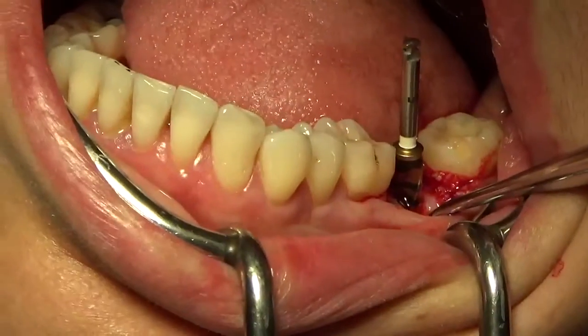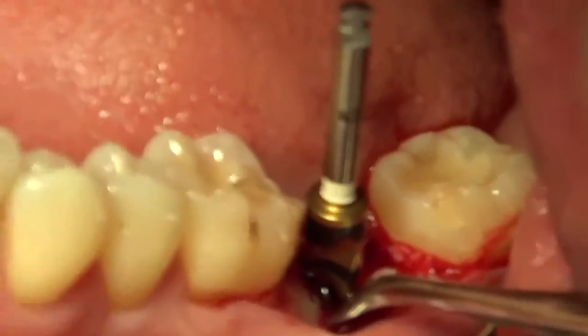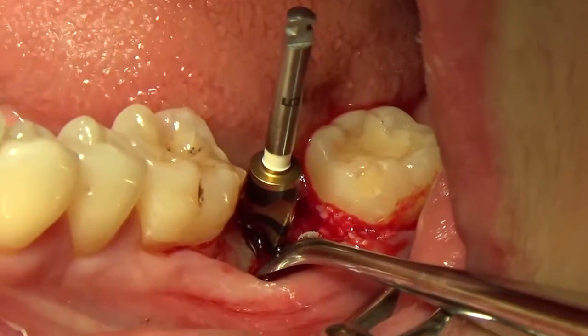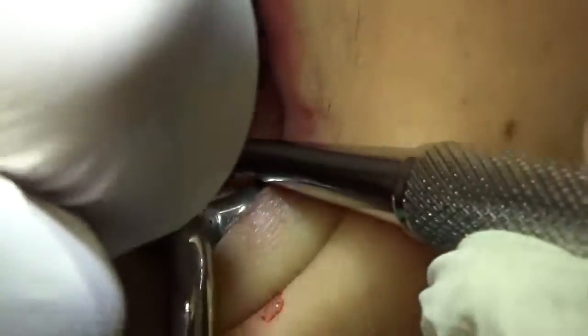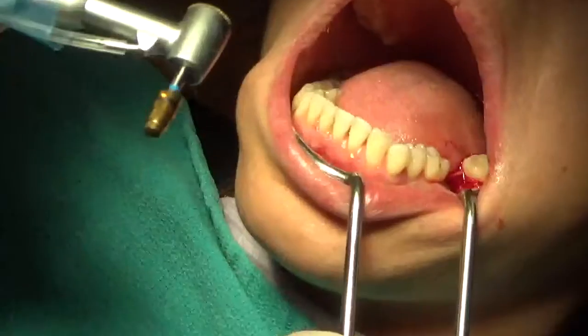But based on the, can you go a little bit more this way, Dr. Sanchez? It gives you a better idea of the buccolingual. Based on the hardness of bone, I think we're actually going to have to use dense bone drills. So that's to depth, that looks good, but I feel our implant's going to be too hard. We set the B drill, this is for the coronal aspect here. You can go down all the way.